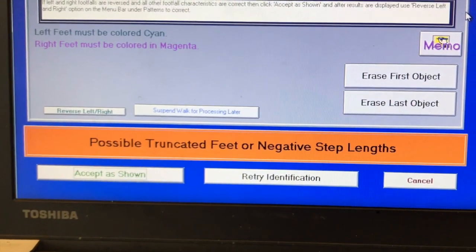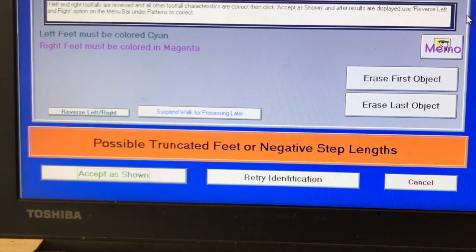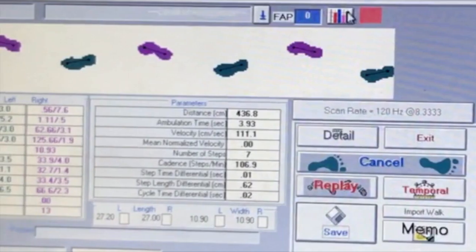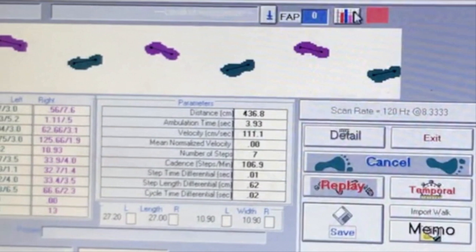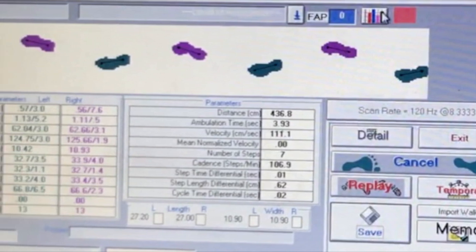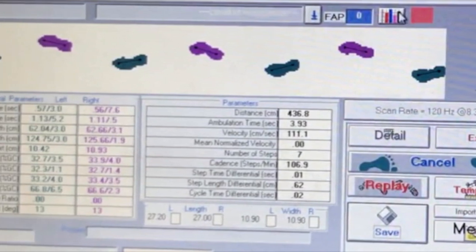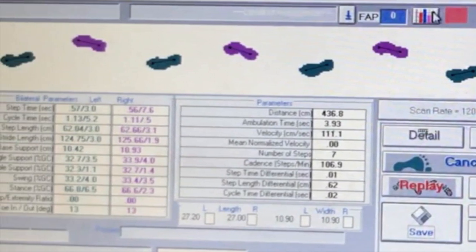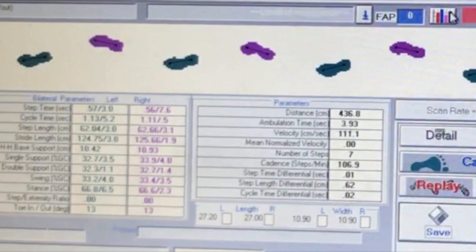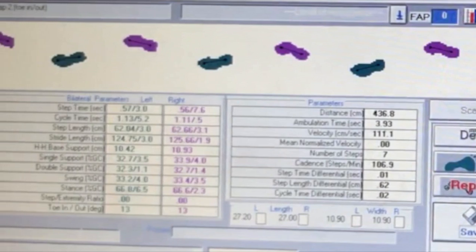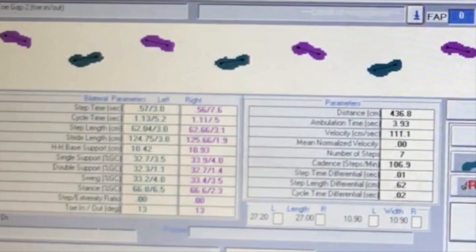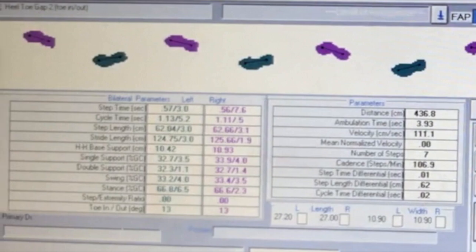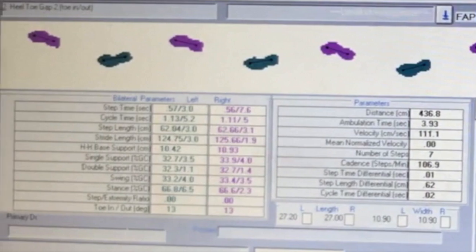On this screen, you will also want to check to make sure the black line you see running from the two black points lies within one footprint. If the black line stretches from one footprint to another, you will also need to press suspend walk for processing later. Refer to the troubleshooting video for how to fix this issue.